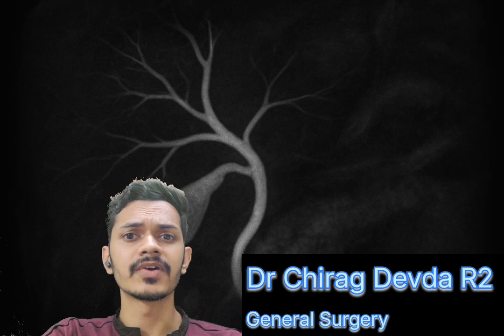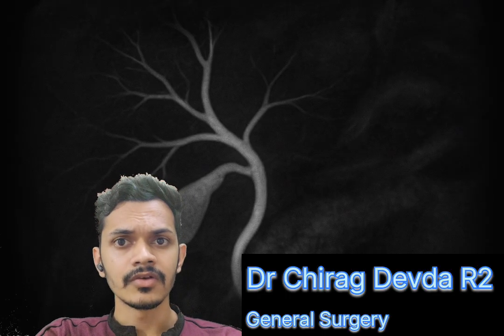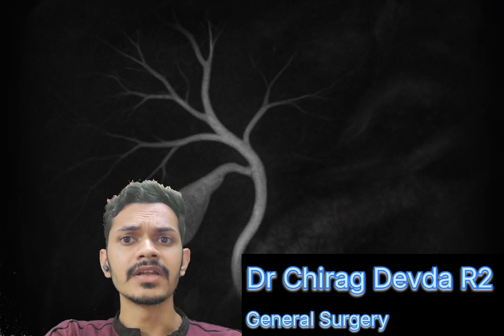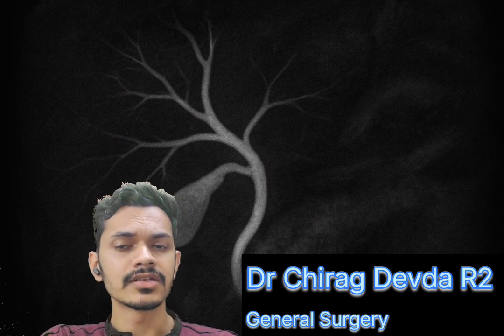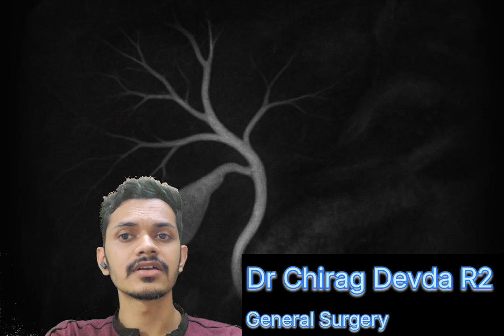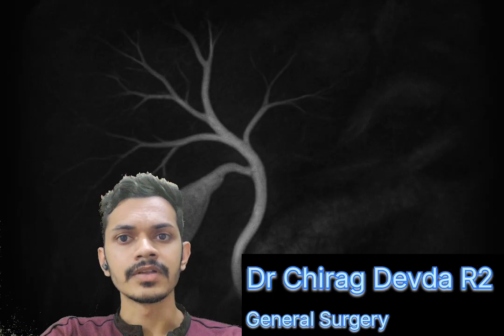Common MRCP findings are CBD stone, a bright duct with a filling defect with upstream dilatation, where the filling defect is seen as dark signal because no fluid or bile is present. Benign strictures look like smooth tapered narrowing. Malignant strictures are irregular or shouldered narrowing. Primary sclerosing cholangitis shows multiple short strictures with beading. Pancreatic divisum shows non-communication between dorsal and ventral ducts.